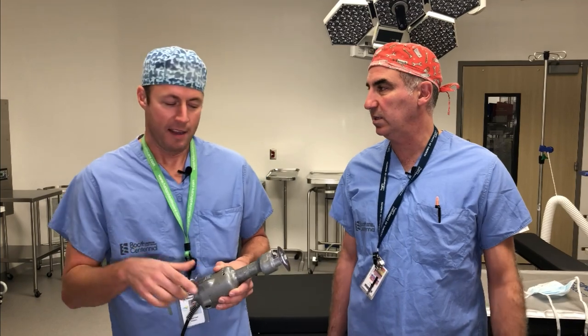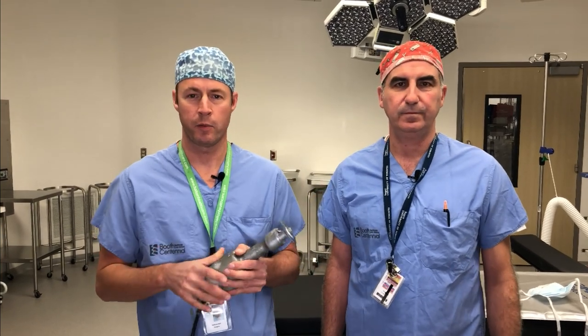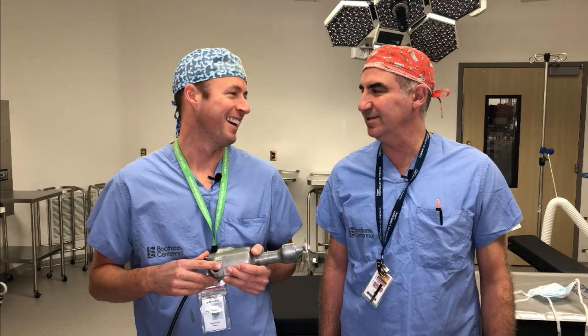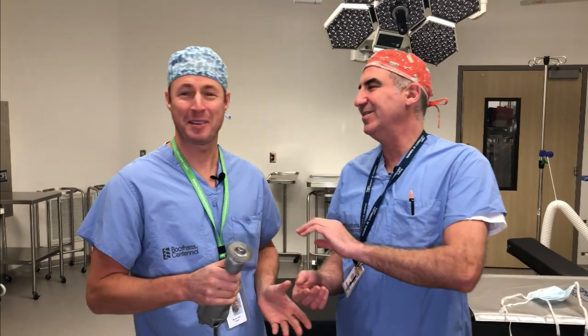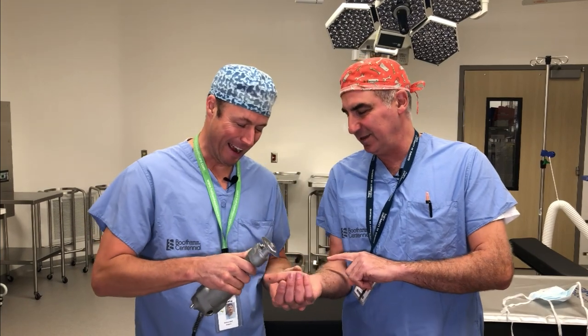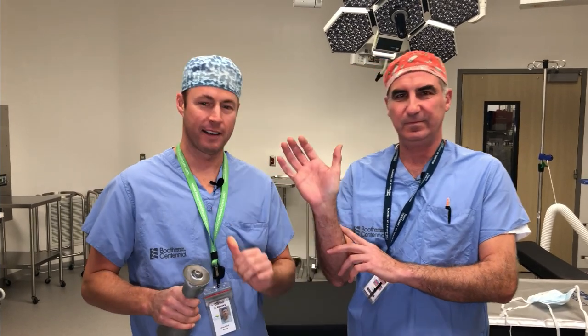Does it cut skin, Dr. Weaning? It is designed to not cut skin. It will kind of rub against your skin if there is constant pressure held there, but it does not cut through the skin. So I'm actually going to demonstrate that now on Paul. Are you sure it doesn't cut skin? I'm quite confident — 80% confident. Don't go right over the radial artery. I'm going to go just on the fat of his hand. Yeah, it doesn't cut skin. It vibrates — it doesn't spin, it just vibrates. So it cuts through the cast and there's still some padding under the cast, so it probably won't cut your skin. But it could get hot and burn if the cast tech holds it there for a very long time. But the cast saw goes on and moves along, and that's why we got one of our colleagues who is a cast technician to take a cast off and show you in a video.